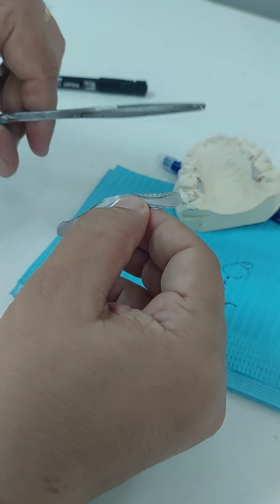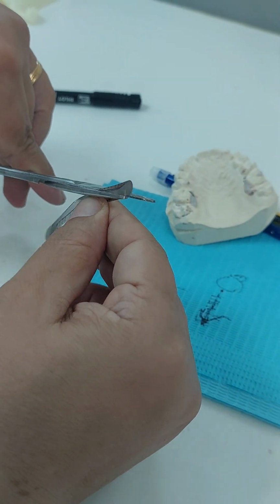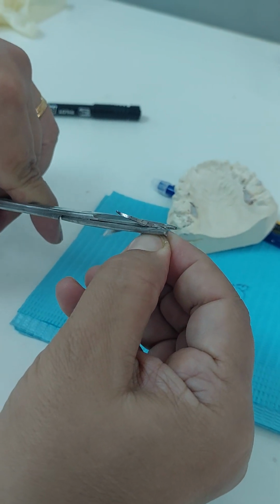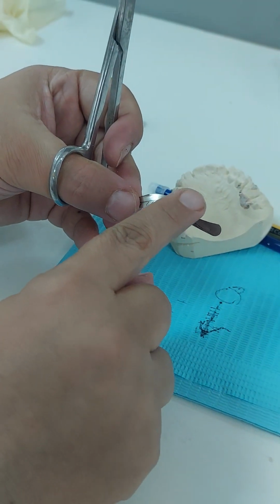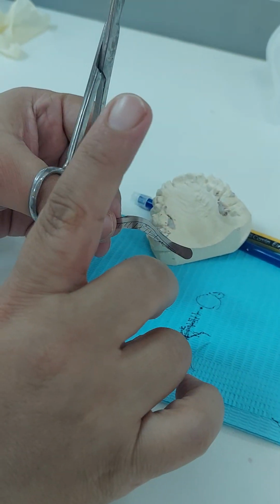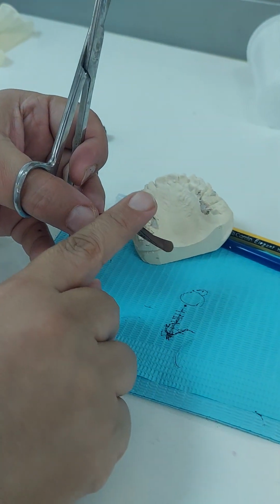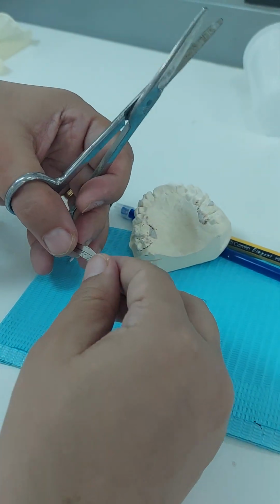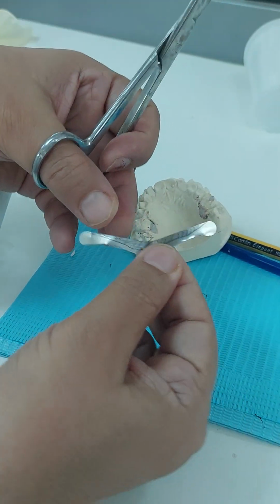The margin. But the problem with scissors is that they leave sometimes sharp margins. So make sure you run a diamond bur, just to round these out. These are sharp now, okay? Make sure you don't cut them and leave them. These will be traumatizing the gingiva. So cut them and then just trim them with a diamond bur or something just to smooth the edges, okay?